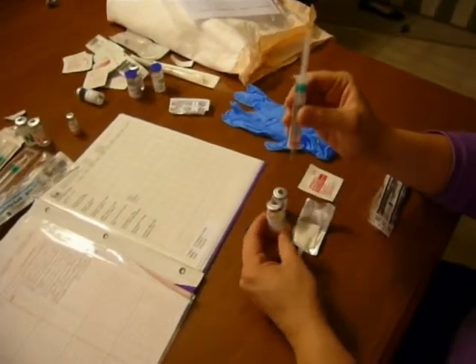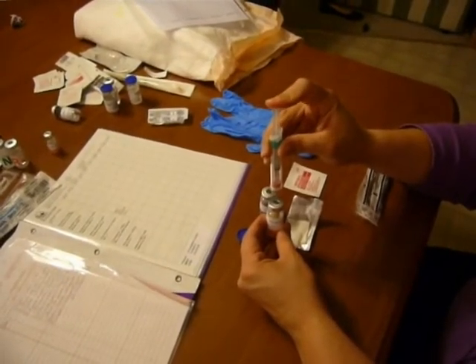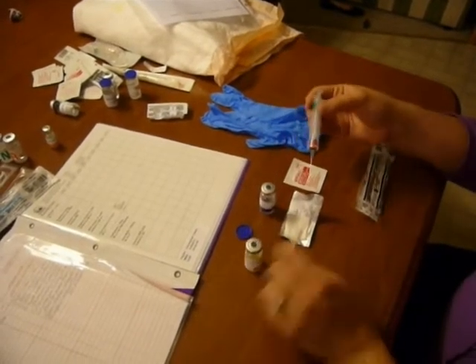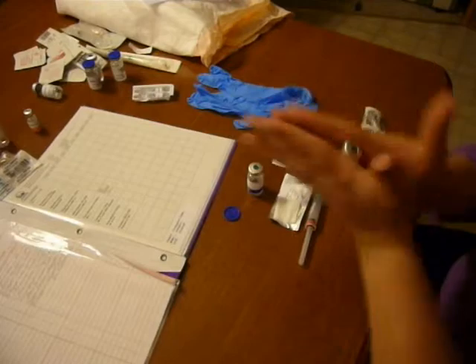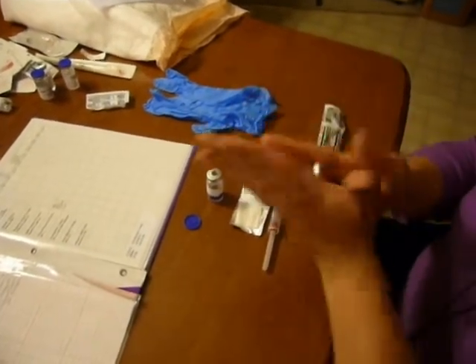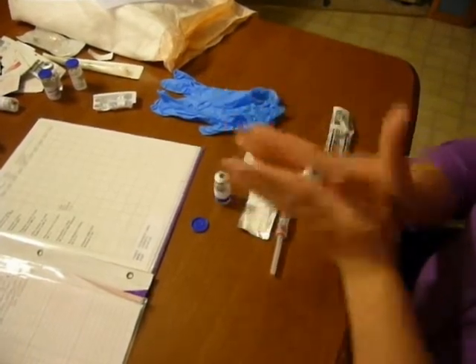Now my two cc's is going to be added to the powder, so I go in at 90 degrees — I've already alcohol'd off the top so it's ready to go. I'm going to take out my needle, cover it and set it down on a clean surface. I'm going to rotate it the same way that we do with other meds like insulin to make sure we don't get a lot of air bubbles in the powder, and I'm going to mix it like this until the powder is dissolved in the liquid, which normally takes between 5 and 10 seconds — for some medications it's much longer.